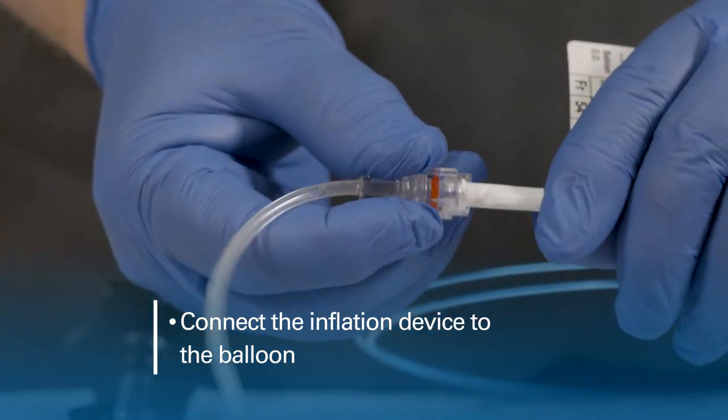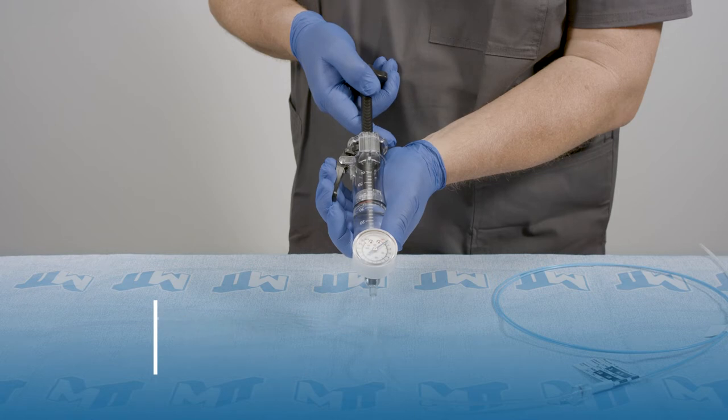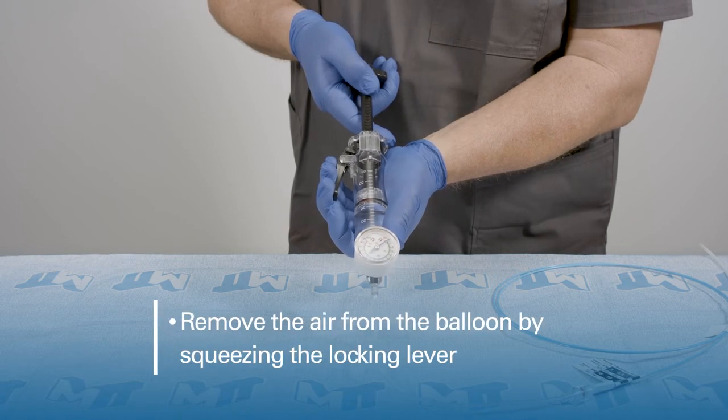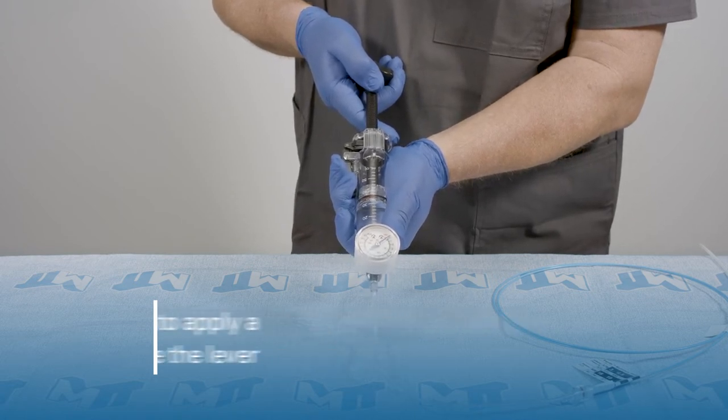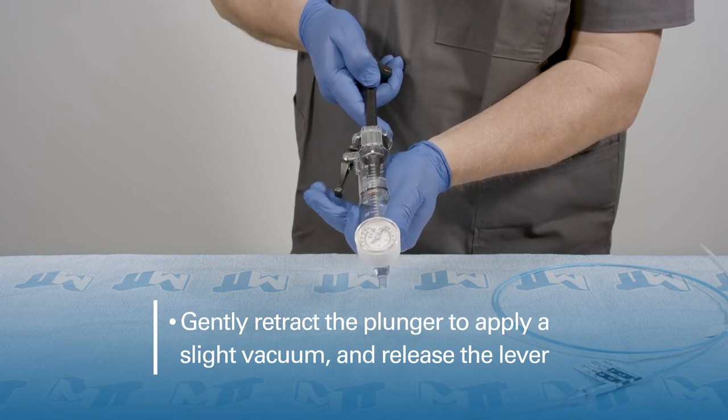Connect the inflation device to the balloon. Remove the air from the balloon by squeezing the locking lever. Gently retract the plunger to apply a slight vacuum and release the lever.